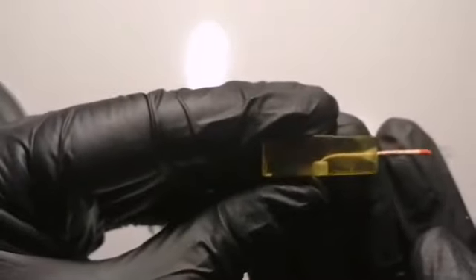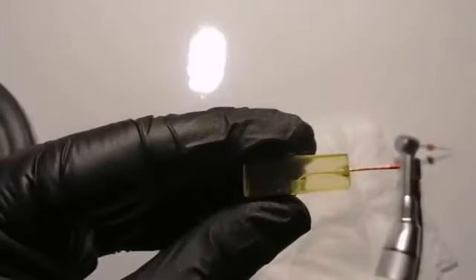As you can see here, the gutta percha is totally fit, reaching the full working length. Thank you for listening.